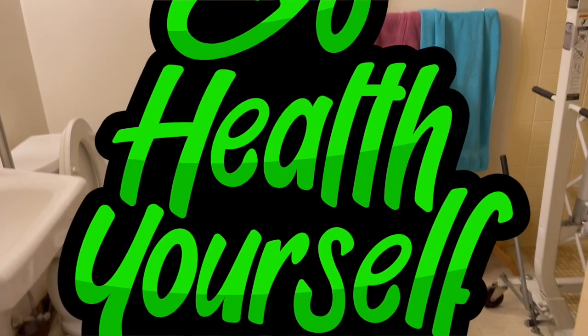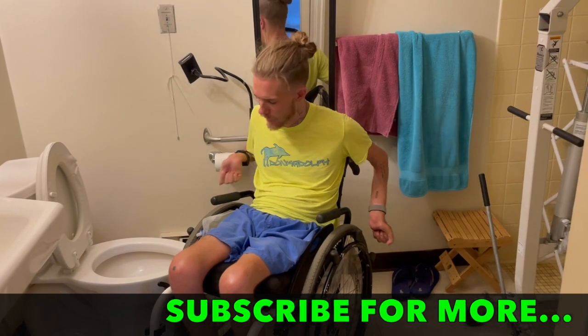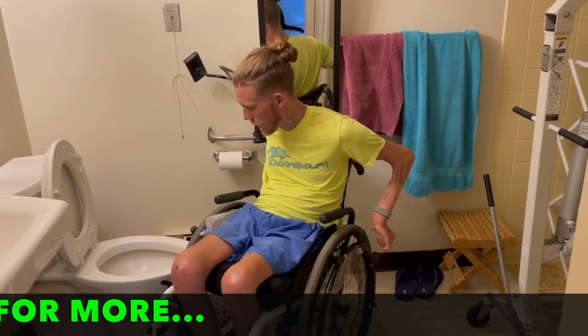Hey, John here with Go Health Yourself. If you're wondering how I empty my bag, I actually keep a leg bag here.